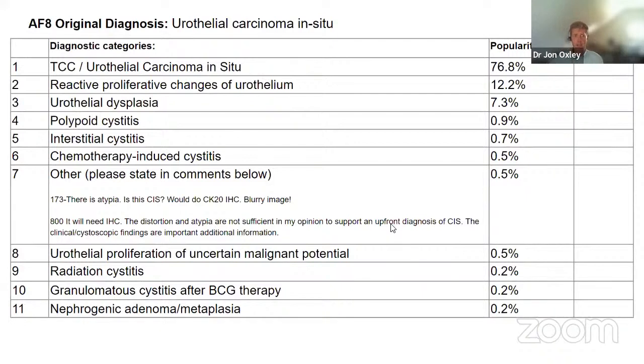And I think we have decided not to score. Is that right, Nick? Nick, are you there? I am. Did we not? I think we were going to decide it wasn't scoring, but we can. It's only just over 75%, isn't it? And there were a lot of comments about the graininess of the image, etc. Yes, I think people were struggling with this without immuno.